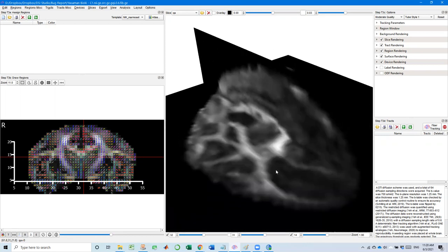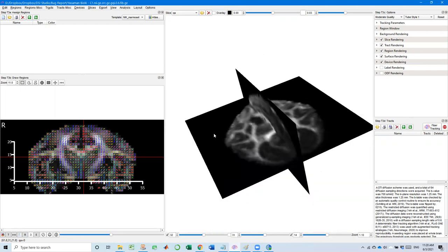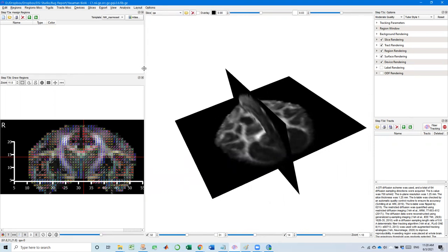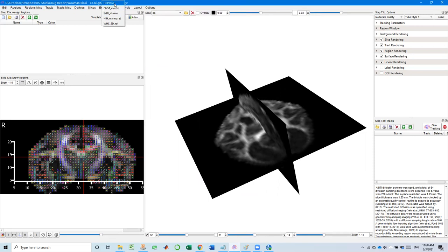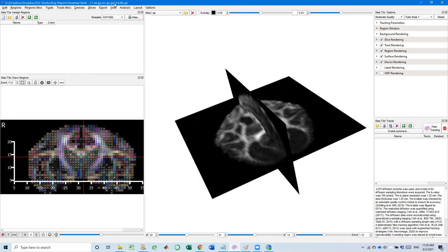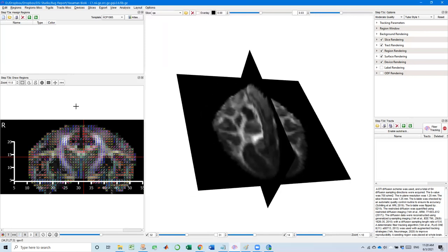Okay, everything's good. Then let's try human automatic fiber tracking. So you will notice here, one key important thing here is the template DSI Studio assigned is marmoset. The way this works out is like DSI Studio will try to match brain size. But here, since we are going to try human automatic fiber tracking, we need to specify HCP 1065. This one is a human brain template. And then we'll see if everything can normalize well. If not, then probably it's not going to work out.